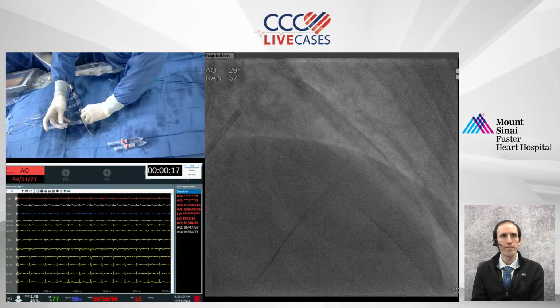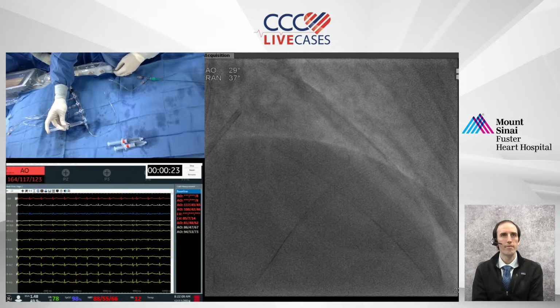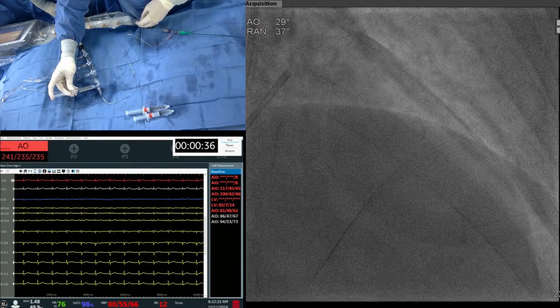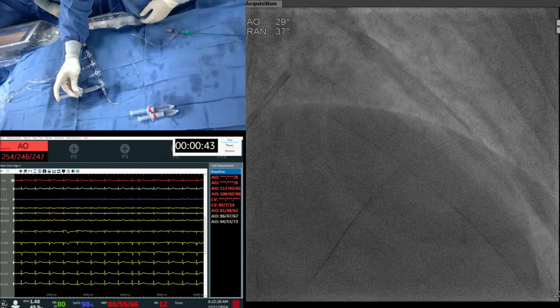There we go. Okay, so the 12 lead EKG is extremely important because the main side effects of acetylcholine that we see are bradycardia and pauses, and sometimes block. A lot of that is dependent on the rate that you're infusing the med. So I started the timer, and ideally I like to deliver this over a minute. So I'm slowly infusing this, watching her heart rate.